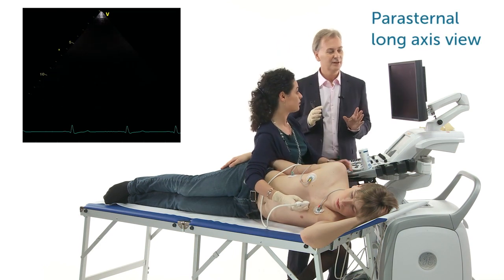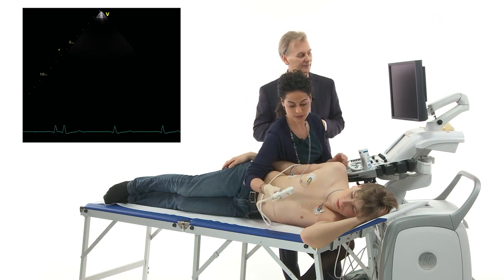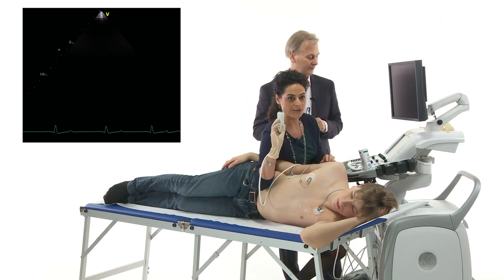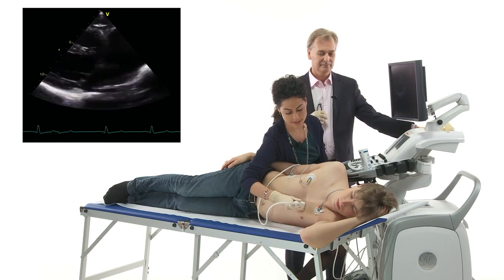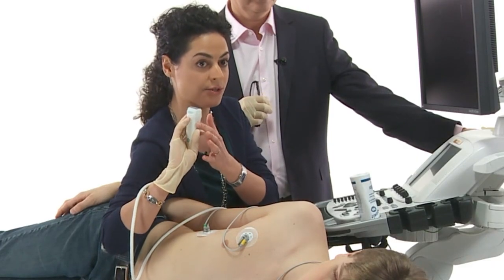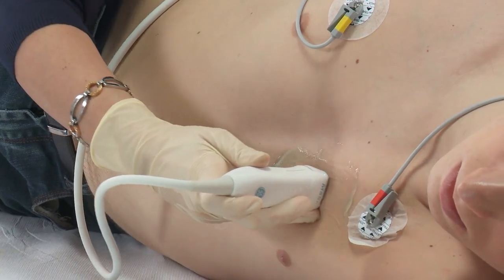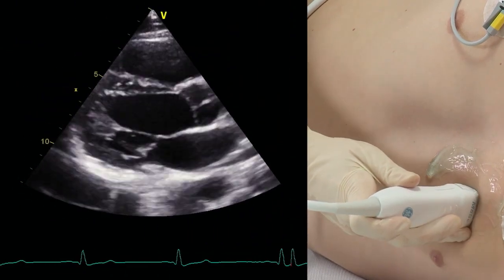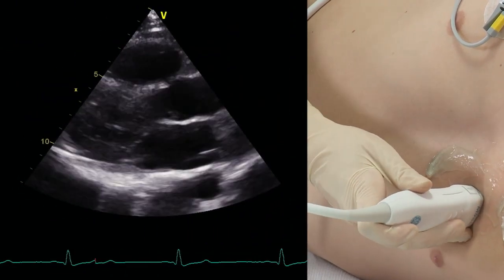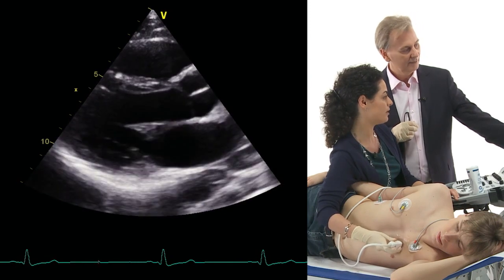We have to show you exactly how to orient the transducer. Exactly. So again, the transducer goes around the second, third intercostal space, and the marker on the transducer is now pointing at the right shoulder of our patient. So simply playing around, we get in a few seconds a really amazing parasternal long axis view.